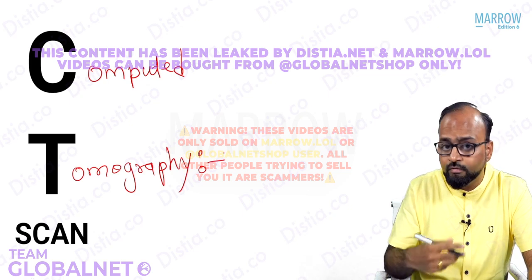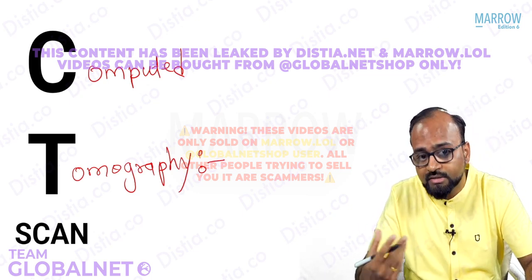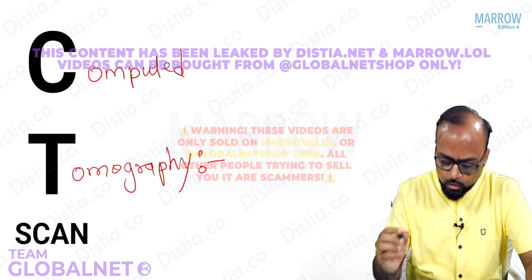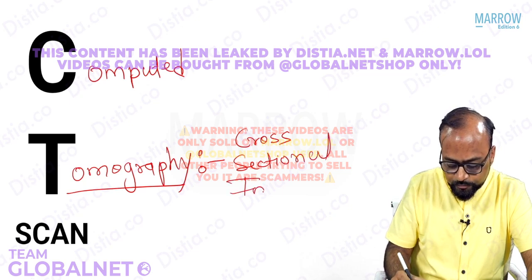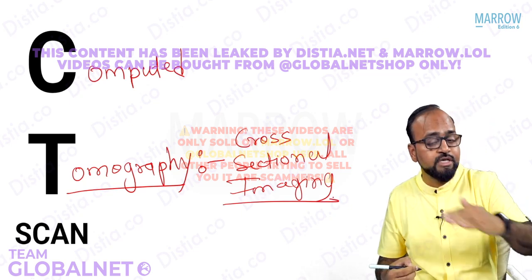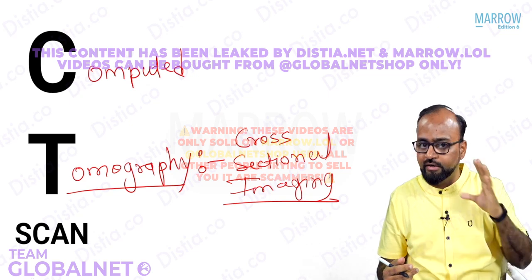You'll come across this tomography in multiple places: PET scan, positron emission tomography, SPECT scan, single photon emission computed tomography. What is the meaning of tomography? Tomography means cross-sectional imaging. Any technique which helps us get cross-sectional images of the patient's body is called a tomographic technique.